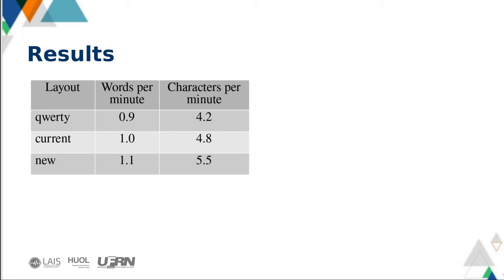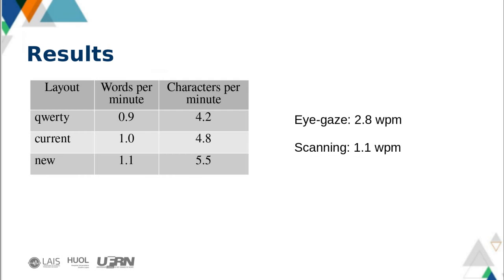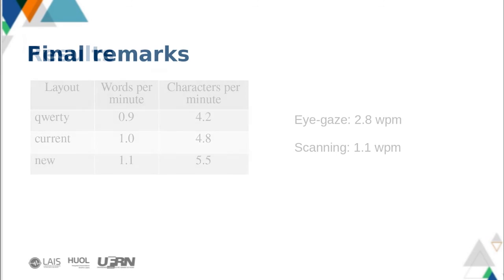Also, with constant use, the user would get better with the keyboard usage, resulting in an increasing average of words per minute count. Although our keyboard uses a method of scanning each key to select a letter, it's showing to be quite efficient compared to some keyboards that use devices to capture eye movement to move a pointer on the screen. They are intrinsically faster because the waiting time between one selection and another is only the time taken to move your eyes in the desired direction.